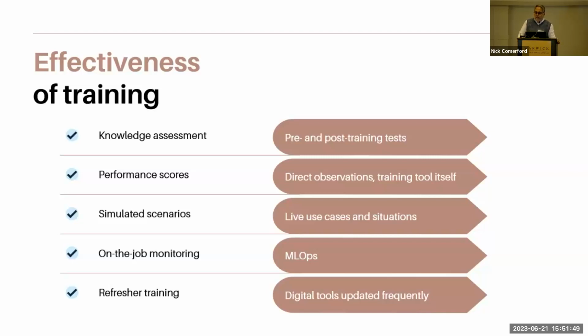One of the things we'll start seeing a lot is a big part of your time from a human factors and usability perspective is going to be spent on these tools, because it's much more effective than bringing in customers in a customer experience center or having a training center.